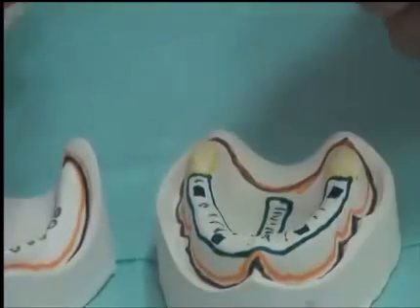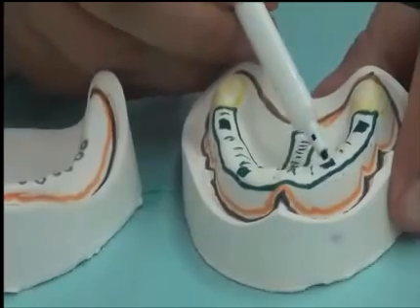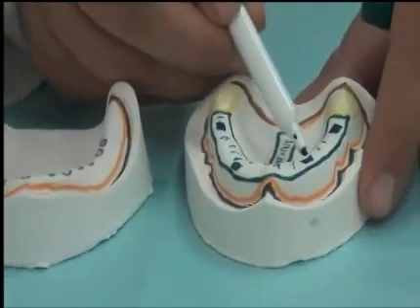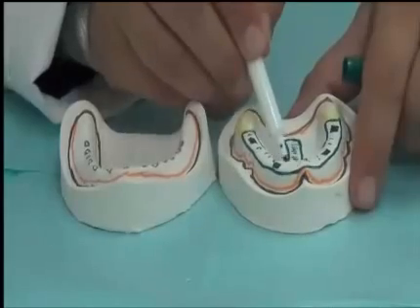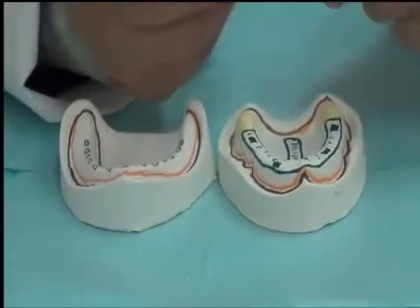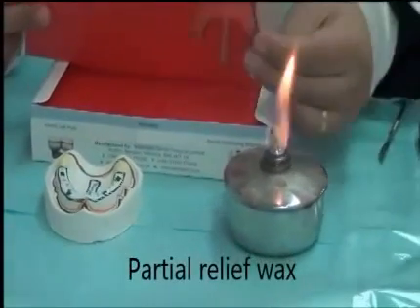Now you're ready for the step where you're going to draw the outlines and then consult with your supervisors and helping staff to confirm that the outlines are sufficient for the purpose. You have 10 minutes to make the partial relief wax.